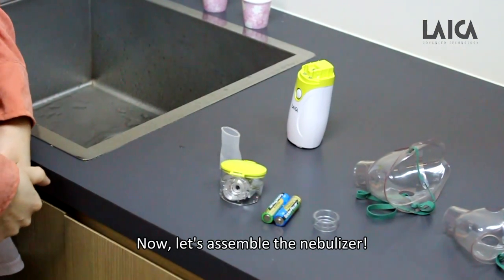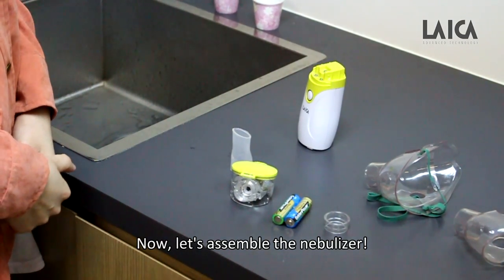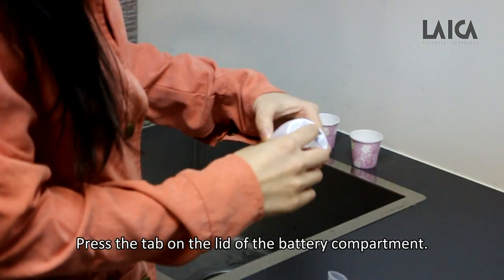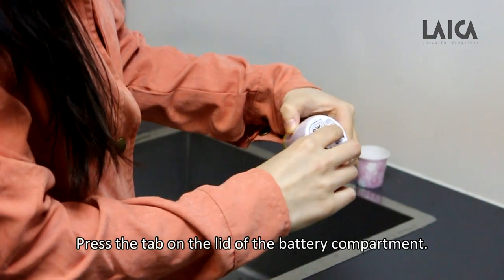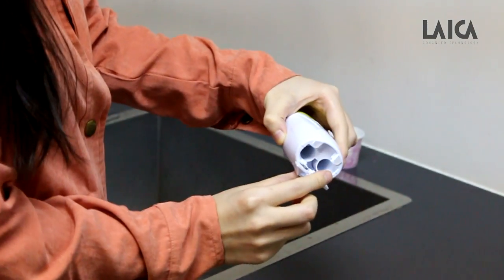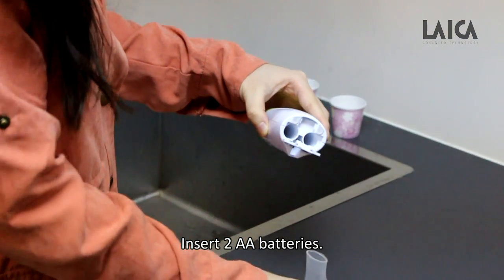Now let's assemble the nebulizer. Press the tab on the lid of the battery compartment, then pull it up and insert two AA batteries.